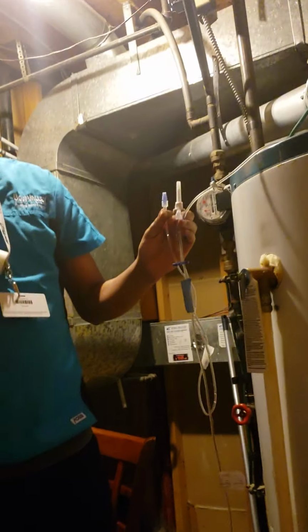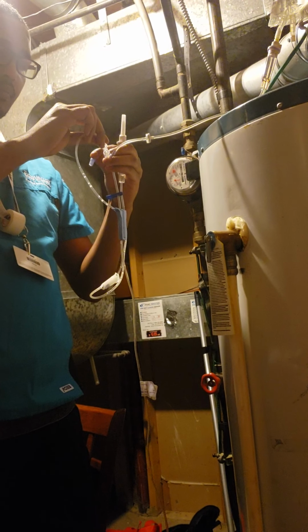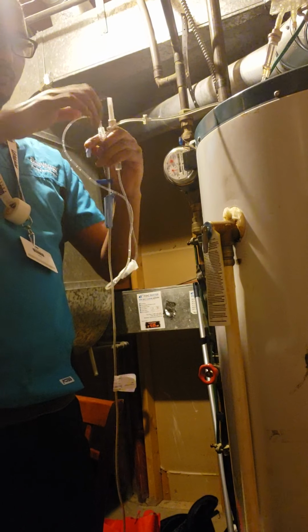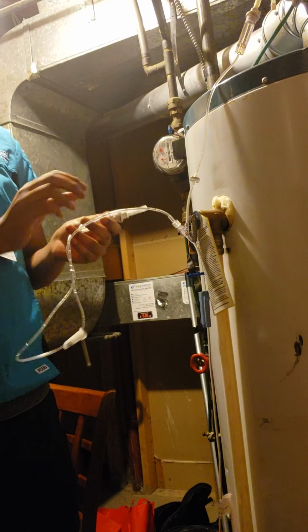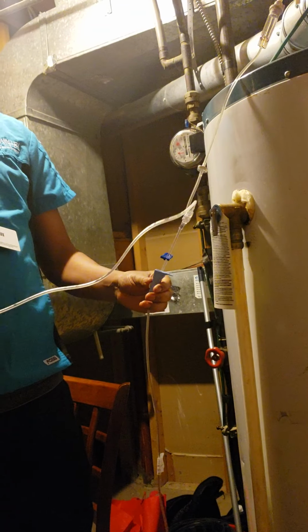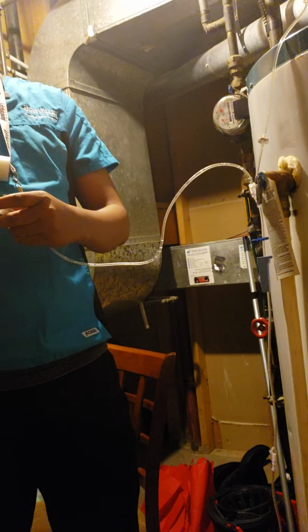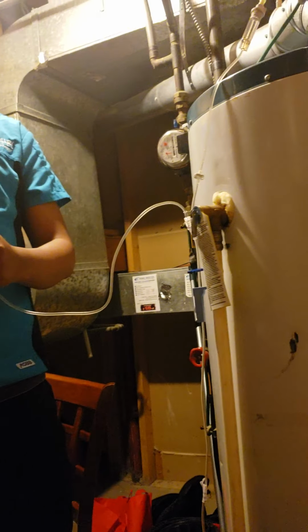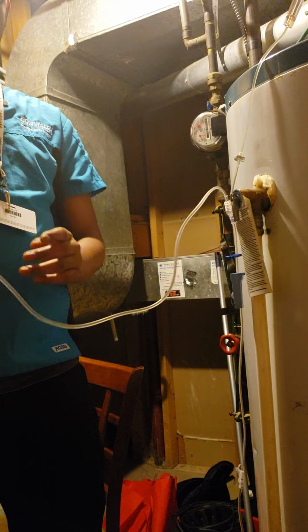Okay, put it in the garbage and then connect it. And then prime it. Okay, it is primed now.